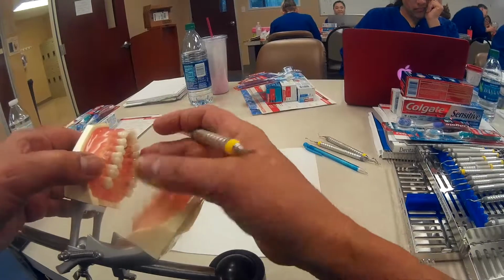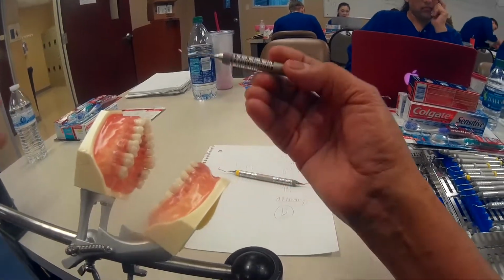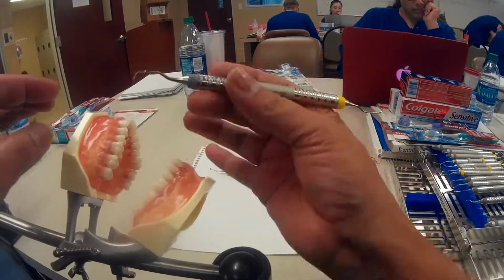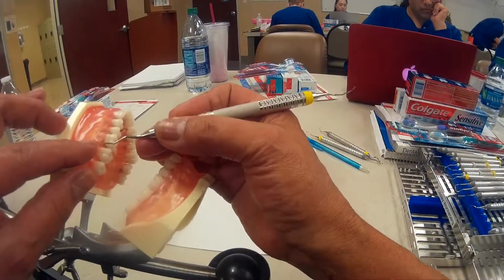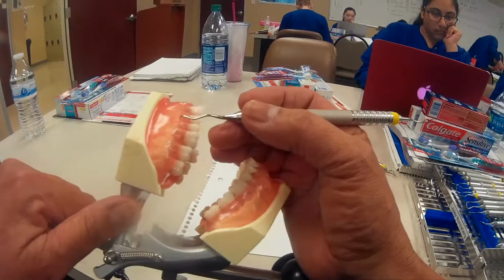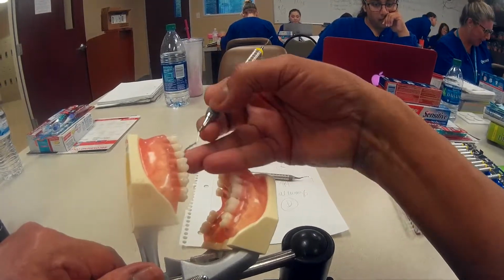If I were going to go up here to the upper right on the buccal, again, let me try to determine which instrument I'm going to need. Here's my curvier end, here's my straighter end, this is the distal, this is the mesial. Let me find my cutting edge. My cutting edge is right here, so this is my correct end, okay? So if I were working with this instrument right here, I'd probably be up here around 11 o'clock, and I'd be using an extra oral fulcrum, something like this, okay?